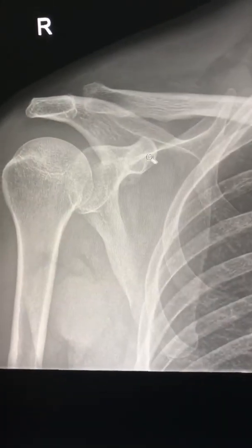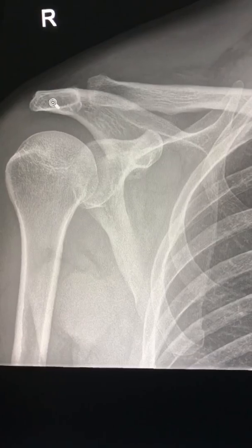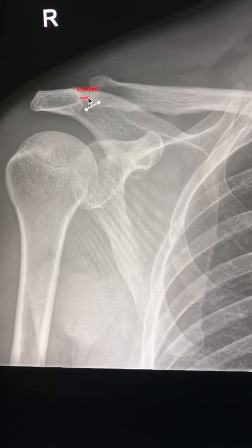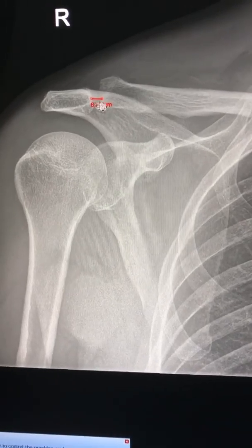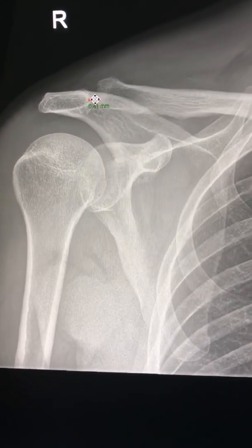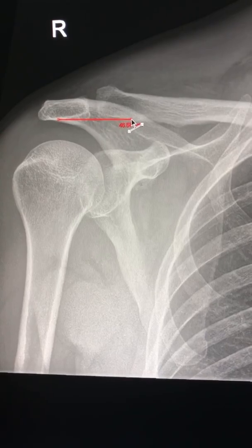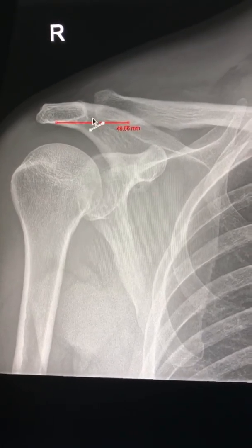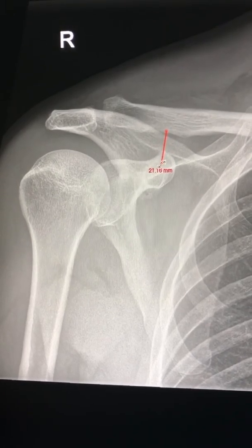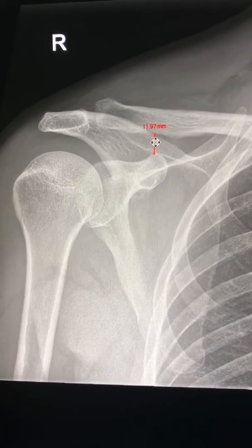Looking at the AP view, the main things we have to notice are the clavicle and the continuity of cortex. We have to check the acromioclavicular joint — this joint distance should always be less than 8 millimeters; anything more than that can point towards AC joint dislocation. Also, the lower cortex of the acromion should be in alignment with the lower cortex of the clavicle; if they are not aligned, it means there is AC joint dislocation.